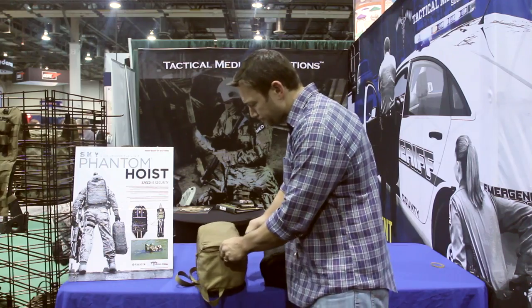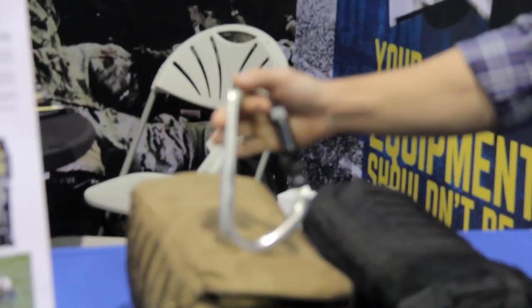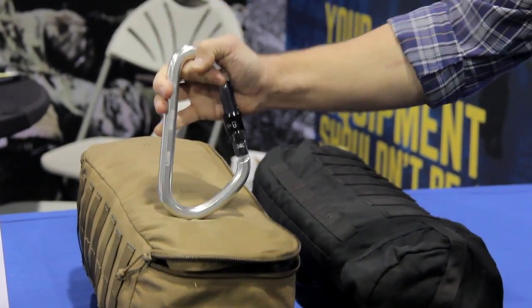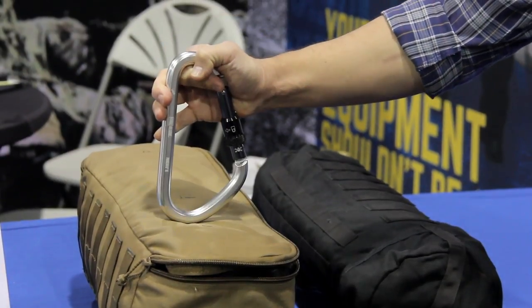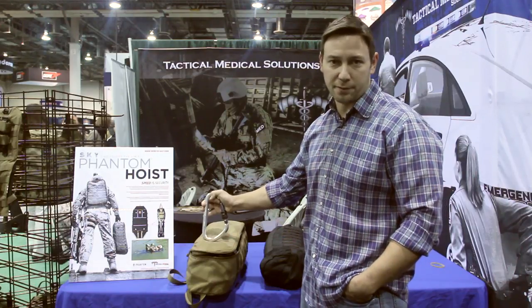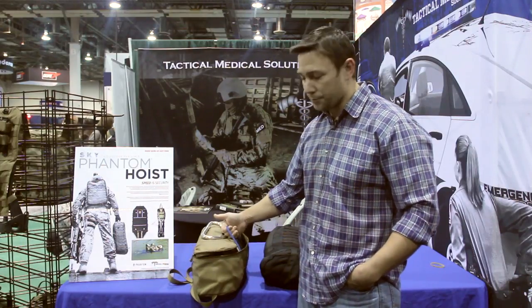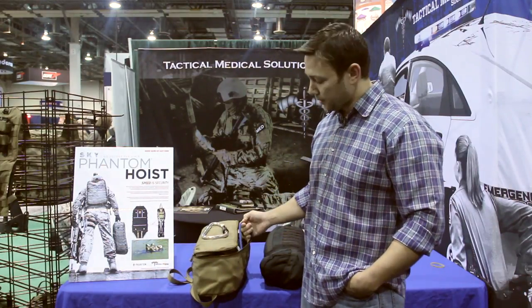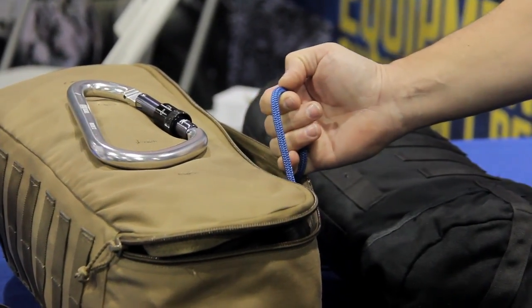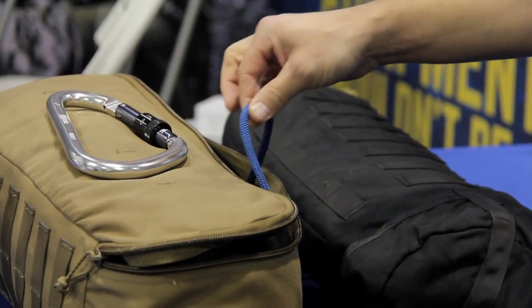The included hardware features a 46 kilonewton rated carabiner able to run the entire system and safely hook in a litter attendant to the same carabiner for easy manipulation in an urban environment, up a rock face, or confined space. It also includes a 100-foot tagline system — a 7mm rope with an 8 kilonewton break strength. In a pinch, you can safely lower a casualty on the system with acceptable safety ratings.